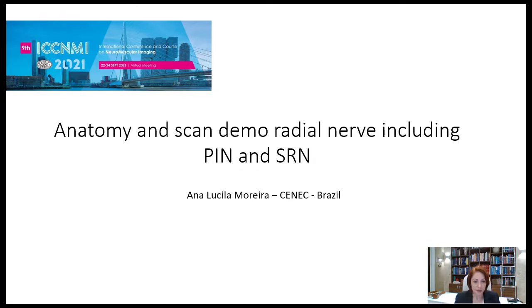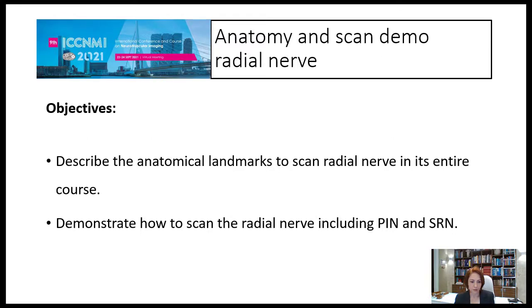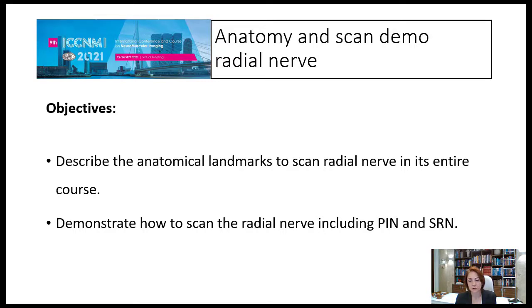My talk today will be about the radial nerve. I'll describe the anatomical landmarks to scan the radial nerve in its entire course and demonstrate how to scan this nerve, including the posterior interosseous nerve and superficial radial nerve.